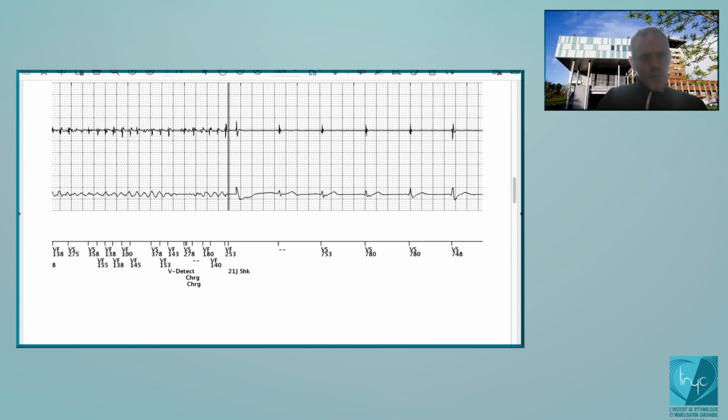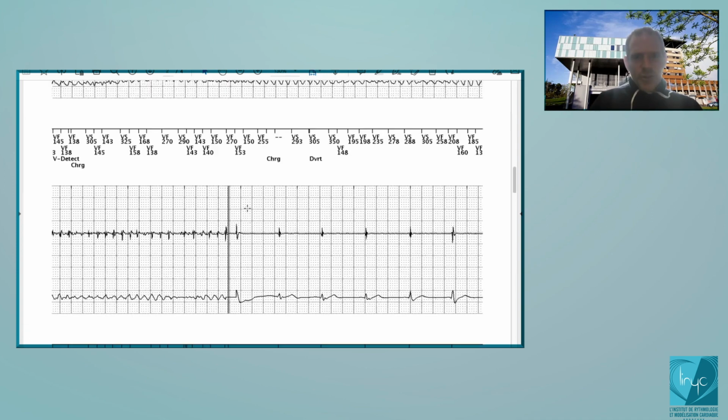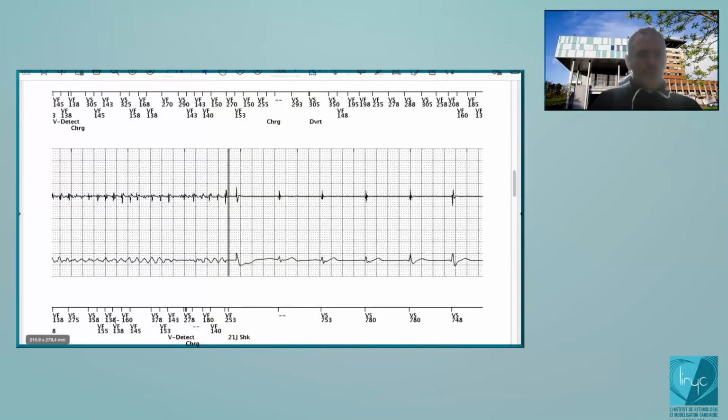So at this time, we'll start the duration that you can reprogram, that can modify the duration. There are 3 durations: the initial duration, the post-shock duration, not this one, and the third one, I don't remember how it is called in English. I think the duration for diversion or for reconfirmation, I don't know exactly, but there is a specific duration here. So now the shock has been diverted. You have re-verified 8 out of 10.